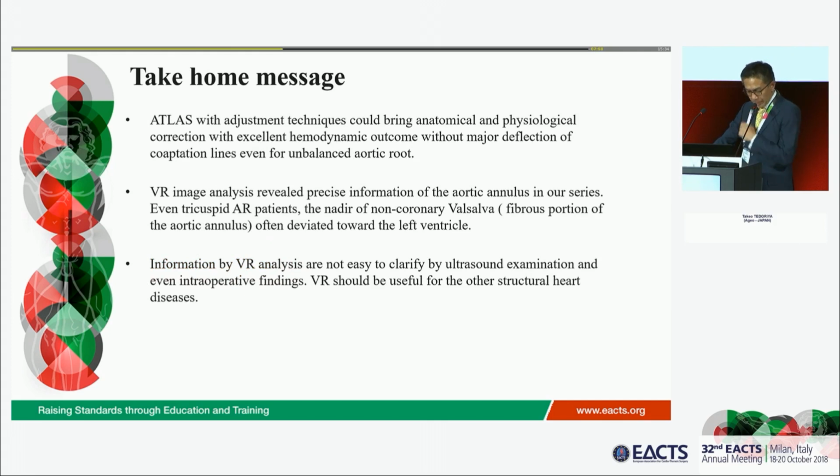So in conclusion, our method with adjustment techniques could bring anatomical and physiological correction with excellent hemodynamic outcome without major deflection of coaptation lines. And the VR image analysis revealed precise information of aortic annulus. Even in tricuspid AR patients, the nadir of non-coronary Valsalva often deviated towards left ventricle.